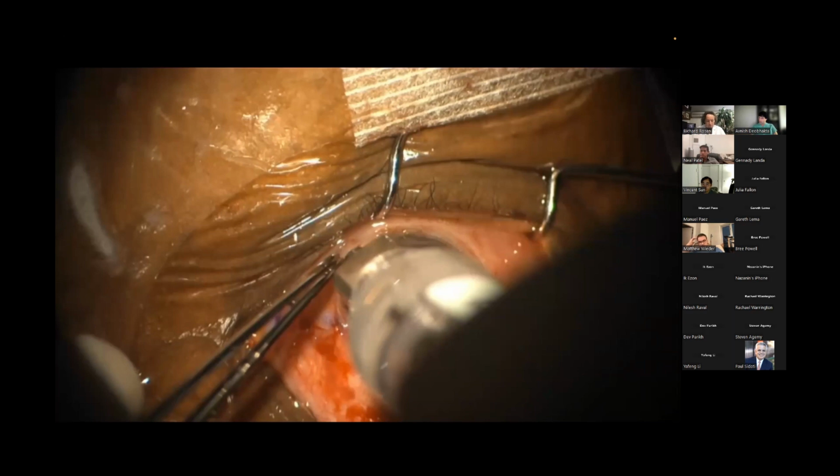What would you do? So usually that's not, I mean, maybe your pressure's too high, but generally the visco will hold. The problem that I have with washing it out with BSS is you don't want it to go in posteriorly, because it may get under your oil.